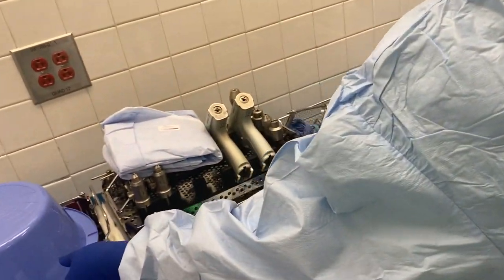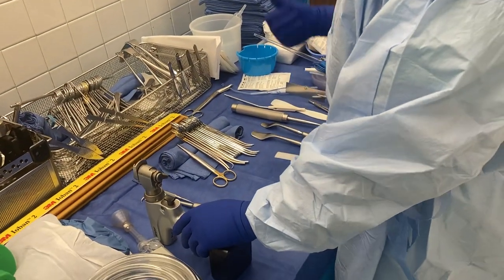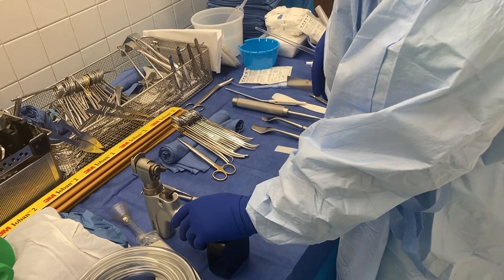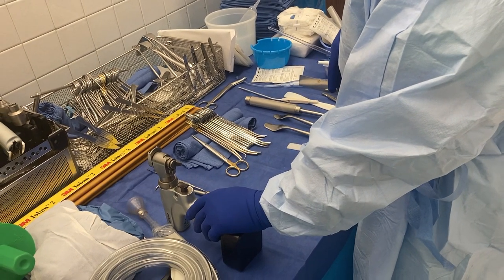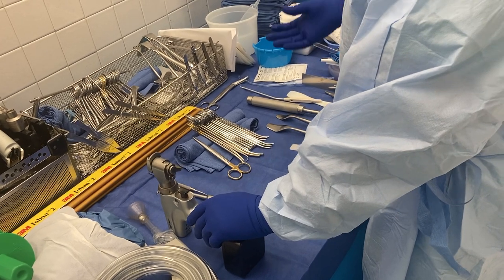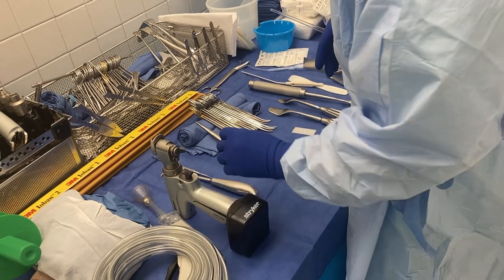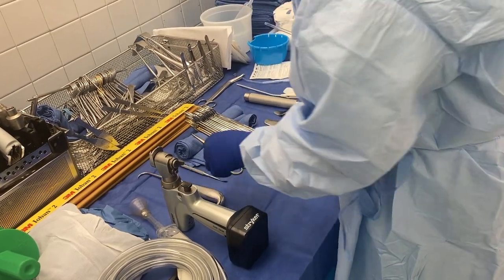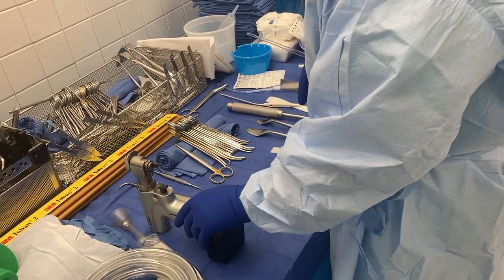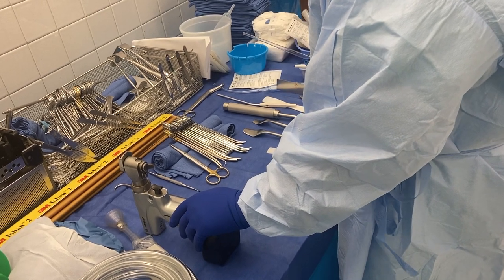We may also do a wound VAC because this is a traumatic amputation. I have it in the corner but didn't open it yet. For traumatic amputations we typically do not close them because of swelling and because they could get infected due to all the dirt and debris that has gotten in there. So this will be an amputation with a wound VAC placement as an addendum.